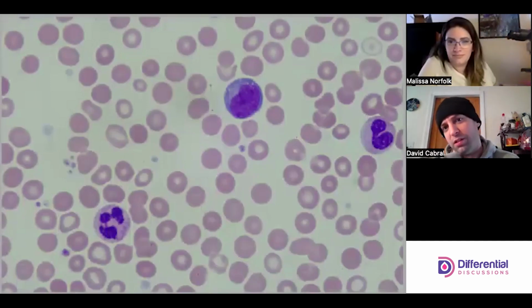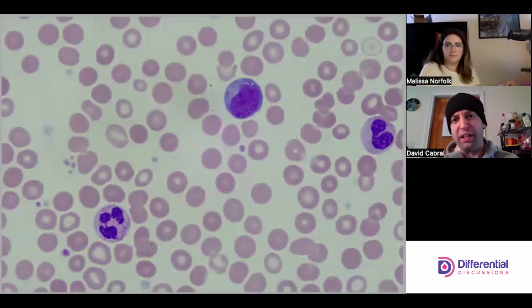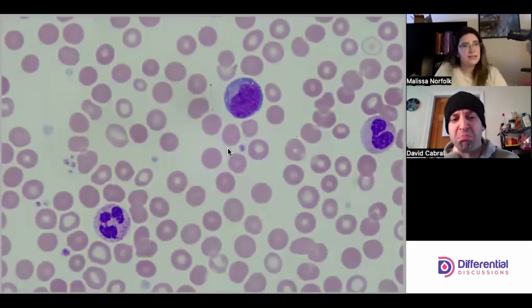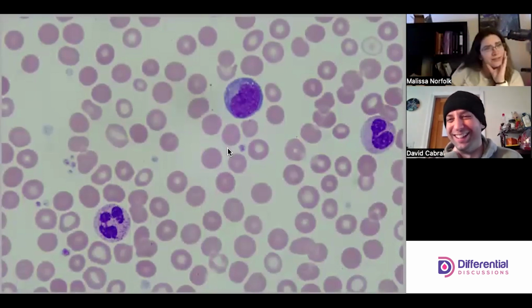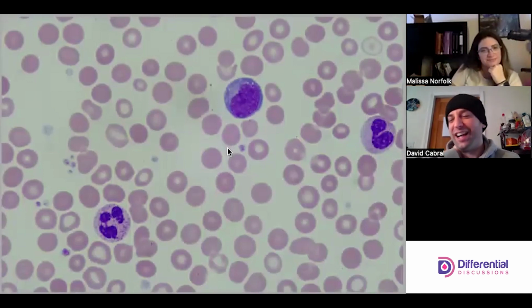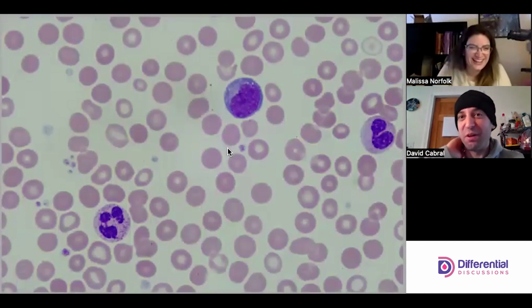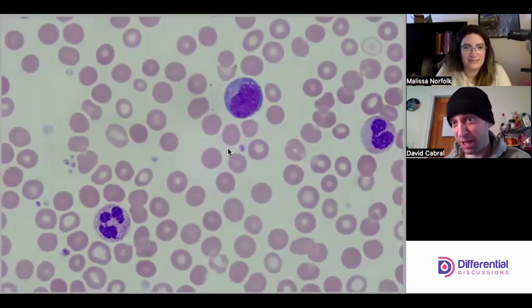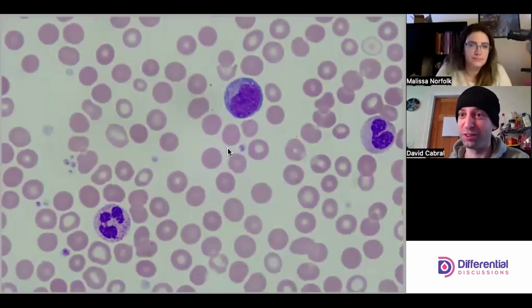Hello. So basophilia, perinuclear halo. I'm thinking some kind of reactive plasmacytoid lymph. But wait, he's not reaching out and touching. How's he reactive? I've got to be honest, a lot of times when we use terms to describe stuff, it gets a little hazy. What I can see is that this one is wanting to maybe go to plasma cell, to terminally differentiate as perhaps a B cell.